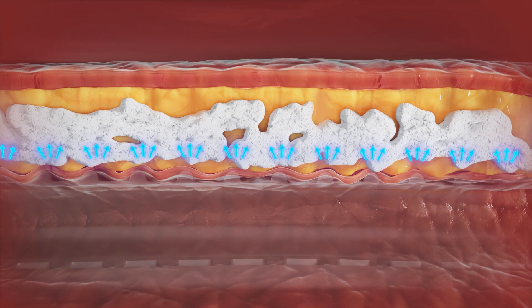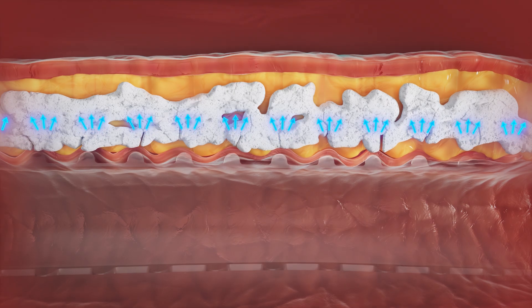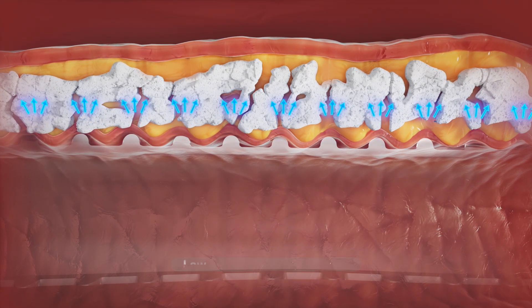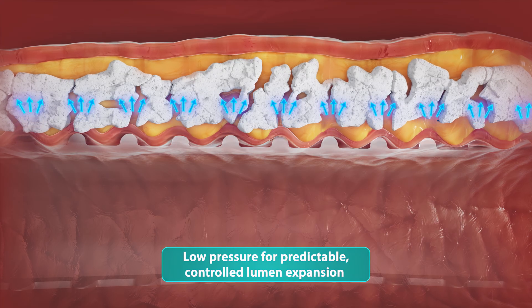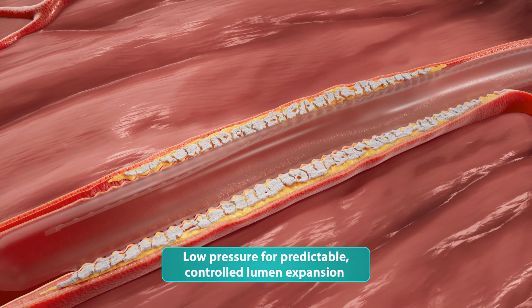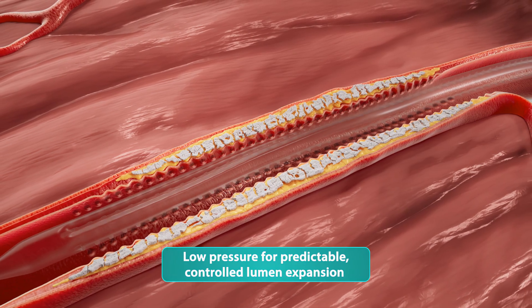As the balloon inflates, the resulting serrated lines are more responsive to directed energy, allowing predictable expansion along the lines. Using low pressure, the serrations remodel the lesion and allow for predictable and controlled lumen expansion.